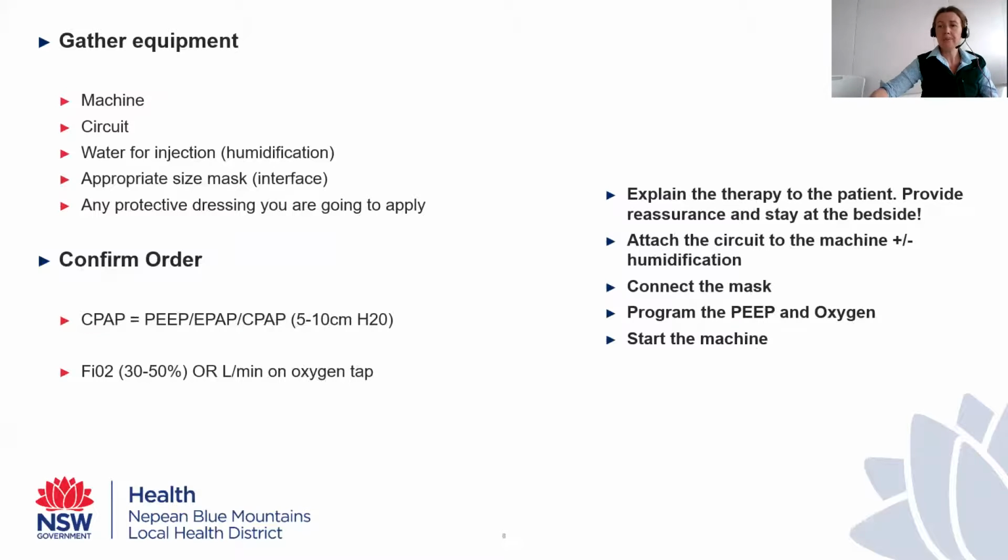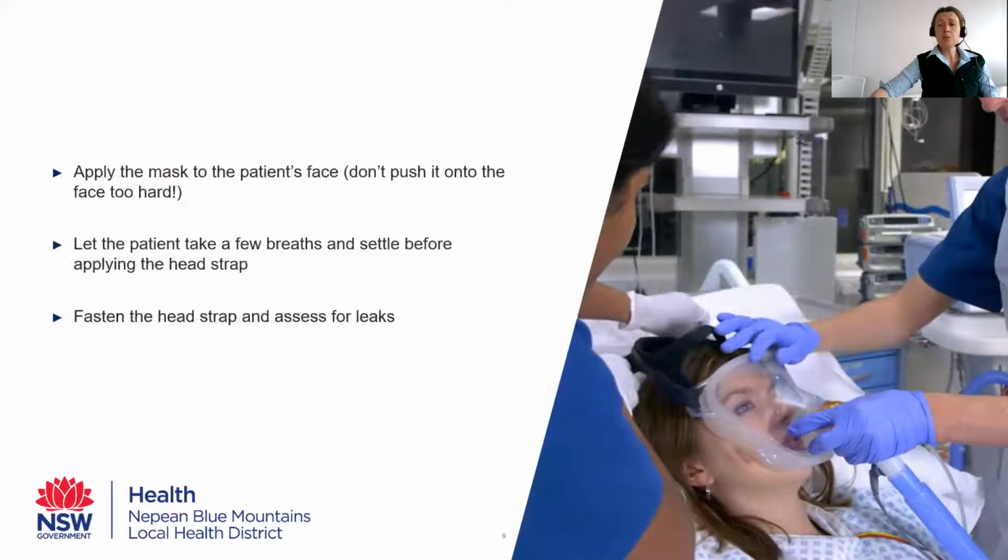Once you've got your equipment and you've got your order, you need to obviously set your machine up, program your machine, and you need to explain the therapy to the patient, and you need to provide reassurance and stay at the bedside while you're initiating that therapy. It's very uncomfortable. It can feel very claustrophobic, and patients need your support to ensure that we can successfully initiate CPAP. So when you start the therapy, you want to apply the mask to the patient's face.